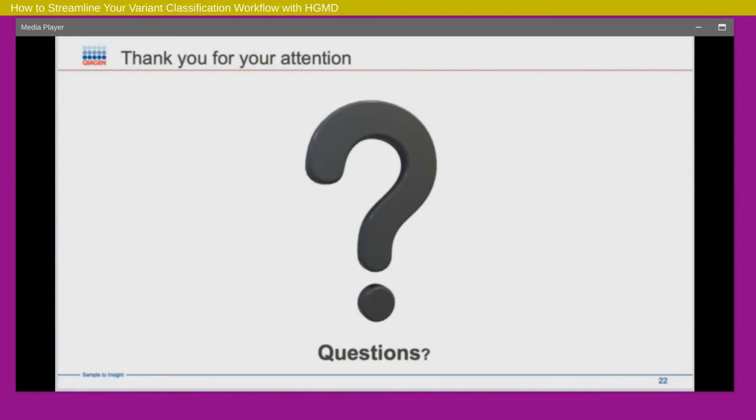So what this means is if you wanted to search for nearby variants, those HGMD entries wouldn't necessarily show up as part of QCI Interpret. You would need the additional license. But for every variant in your VCF that goes through Interpret, for which there's an HGMD entry, you will be able to view that entry as part of Interpret.